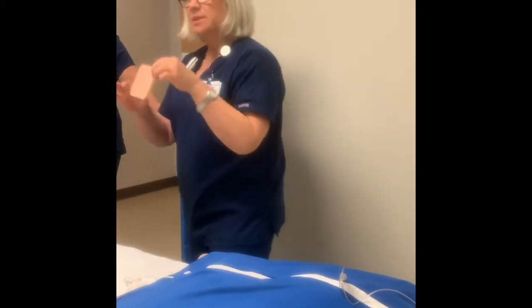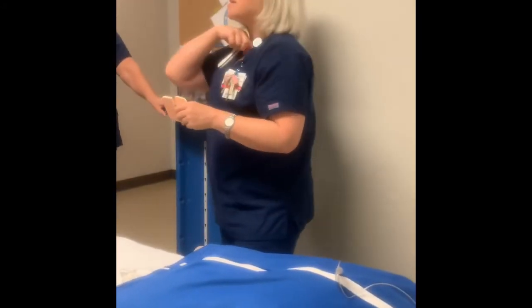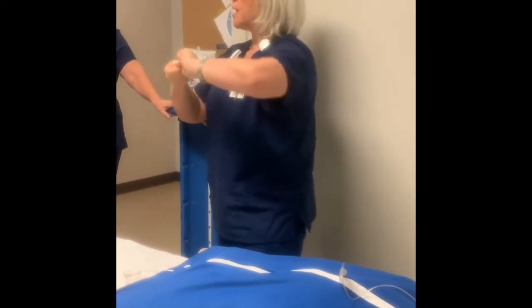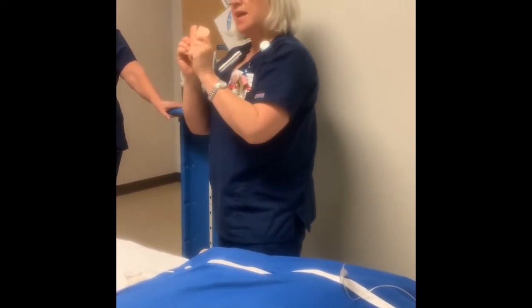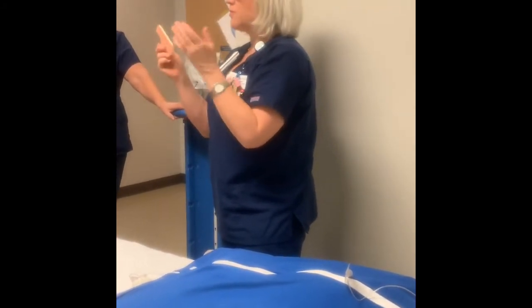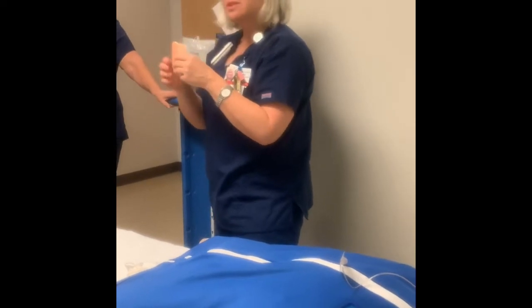The nice thing about these is you can cut these, and you won't get shards like you do with these 4x4s. If you cut those, the shards can get in the trachs. So you can cut them, you can manipulate them. They can stay on for 7 days, mildly absorptive, and they fit beautifully, and they also prevent the breakdown that we see with trachs.